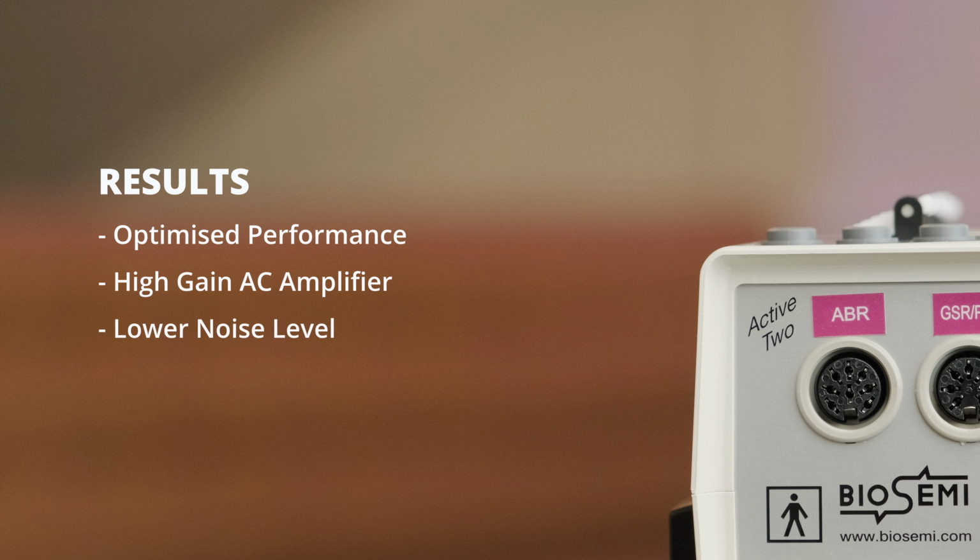The limited number of electrodes allows the selection of components with lower noise but higher power consumption. However, these design choices cannot be used in the standard case where, besides low noise, DC operation and low power consumption are also key specifications.